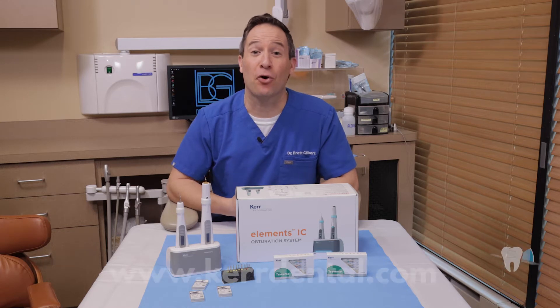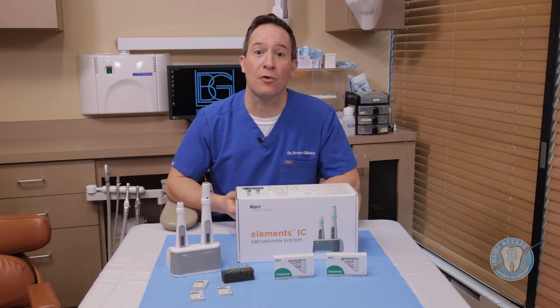Today's episode is featuring products from Kerr Endodontics. The products I want to feature today are ones that I've used in my practice and I really think are worthy of your exploration.